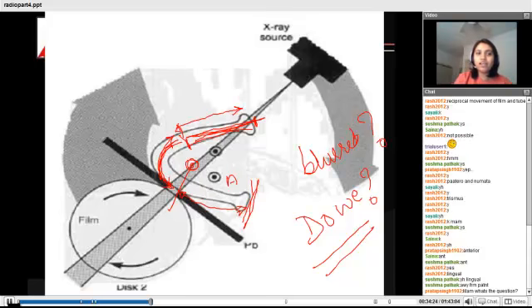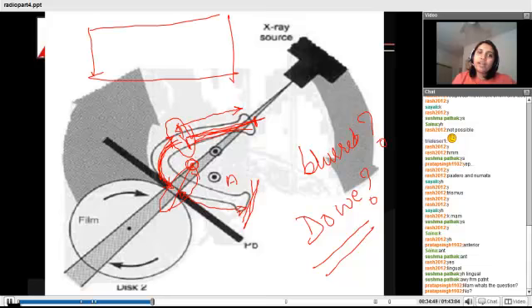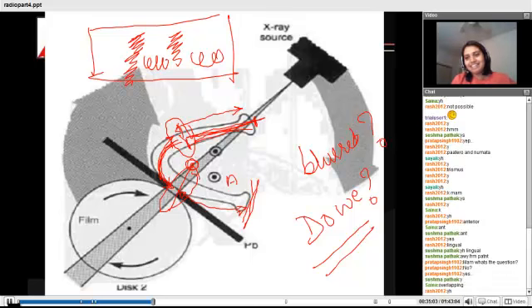Remember, in the first scenario, we got the blurred image in the center. That was a zone where our OPG machine was shifting the centers. This time, we are shifting the centers in these particular zones. Have you ever seen an OPG image wherein you see very good incisors, very good molars, but you see haziness in the premolar zone? Have you seen such an OPG? I know you people are of the new generation and you see very good OPG images actually, so that is the reason maybe.